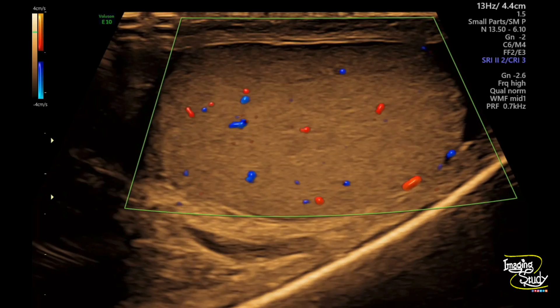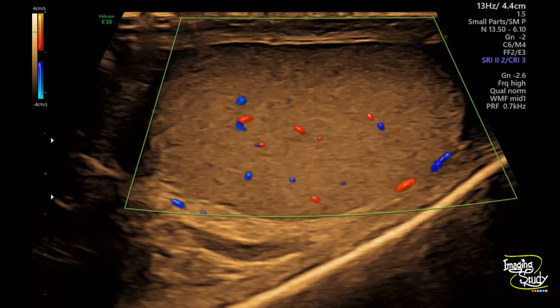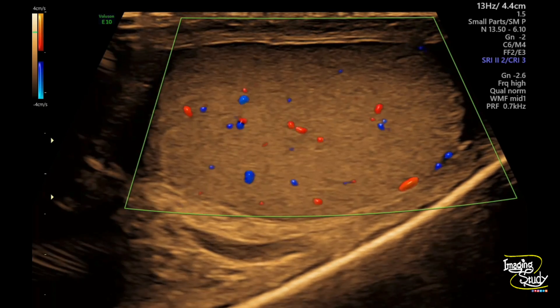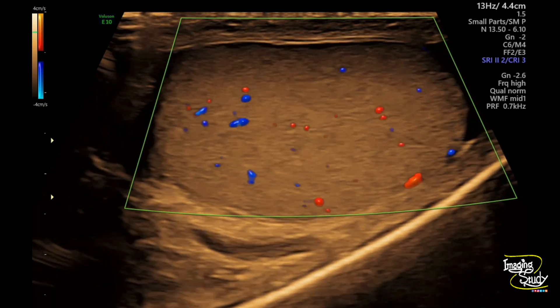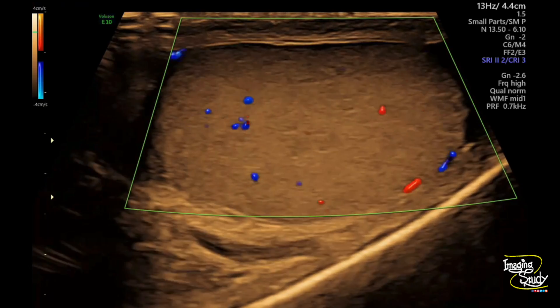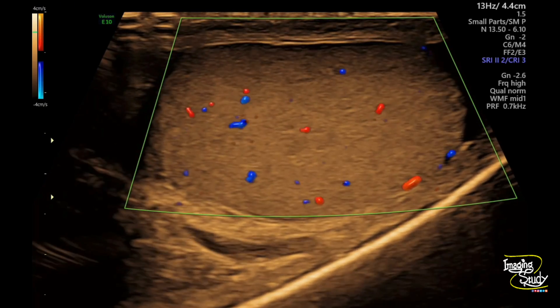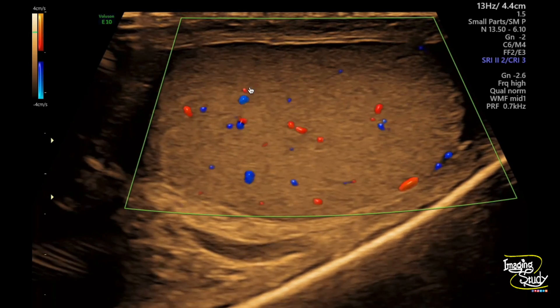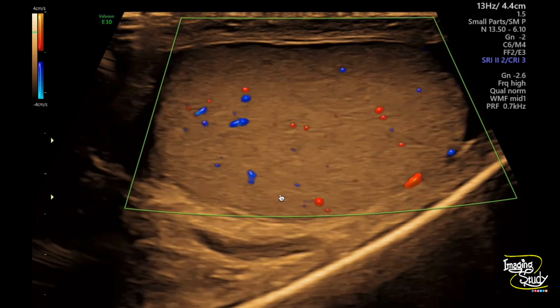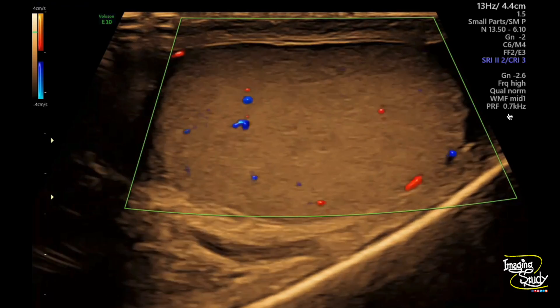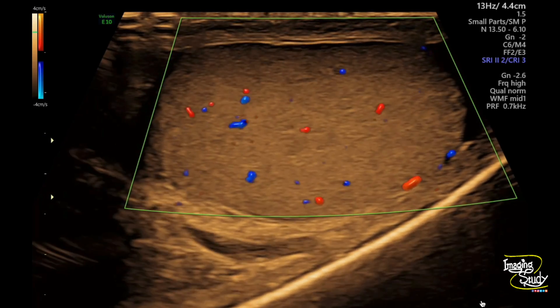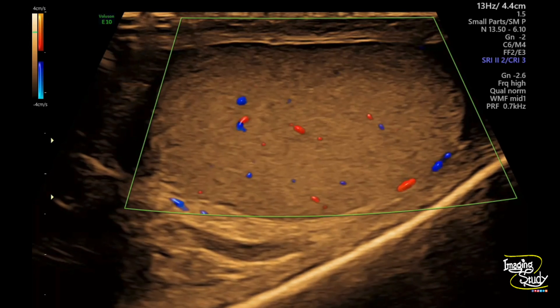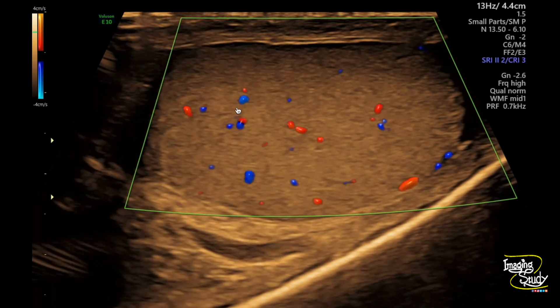Here we have put on color Doppler. As the left testis is the normal one, we want to check that first. We adjusted our pulse repetition frequency and you can see the normal vascularity within the left testis.